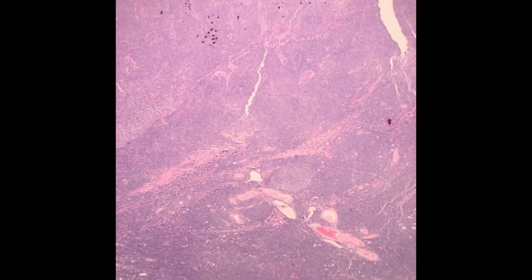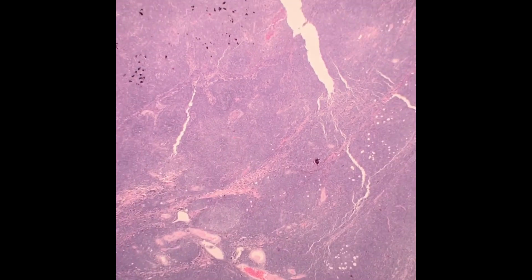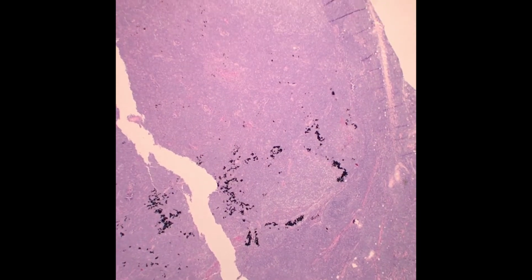So today we have a lymph node from a 55-year-old man who has bilateral axillary lymphadenopathy. This is an outside consultation case. I have no idea if the bone marrow is involved or whether the patient has splenomegaly.